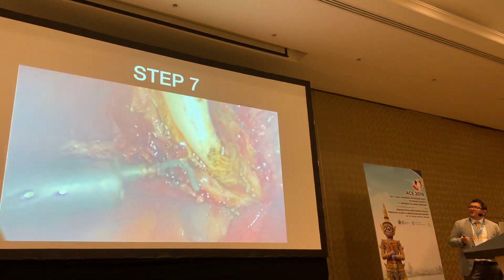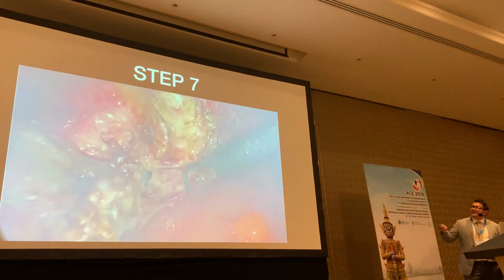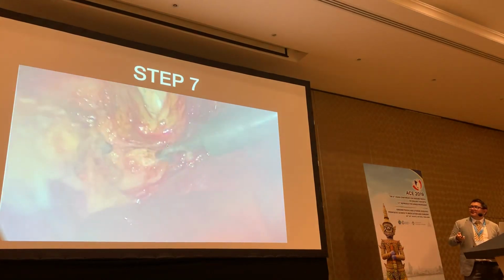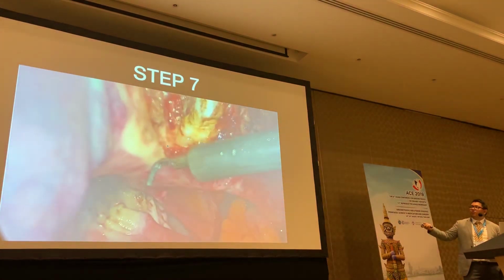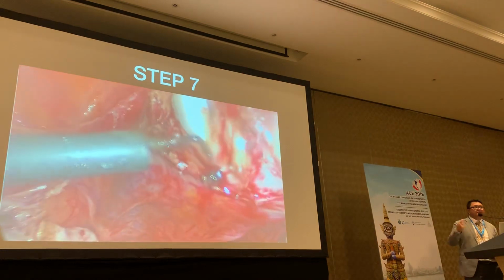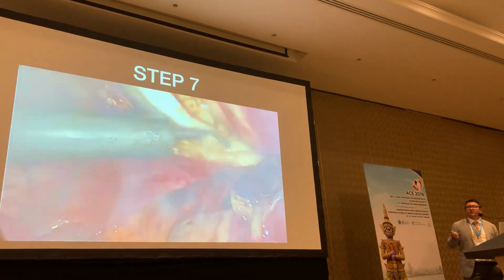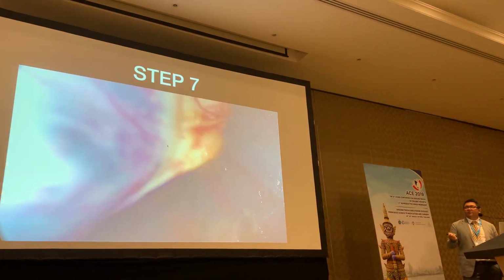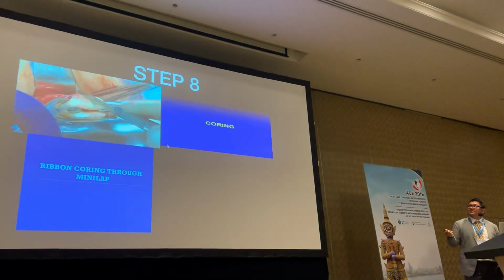And once your vaginal assistant is giving you direction by presenting it, the co-surgeon will take over on the right side, and I like to do the posterior part last because the uterus is well held, so it's not going to slip. There is a valve which is preventing my pneumo from being lost, and you can see the posterior is very important, that we're not cutting the uterosacral, so we're preserving the pericervical ring. This is going to prevent dehiscence of your vault and not give you vault prolapse in future. So there are many small steps that enable you to do a procedure perfectly without complications. And how do we remove the uterus? There's many ways. As far as we are concerned, vaginally is the best way.